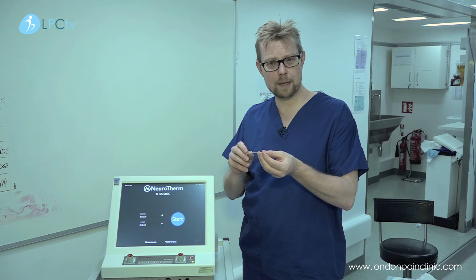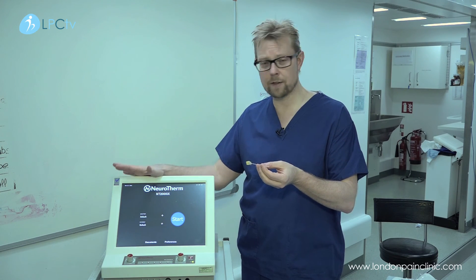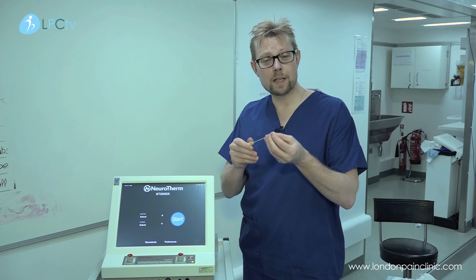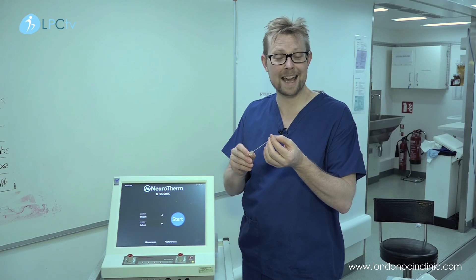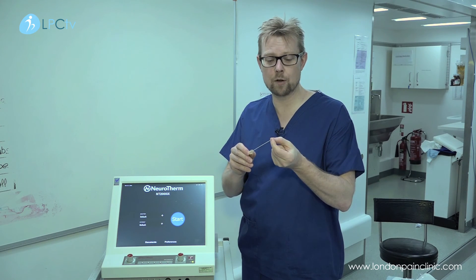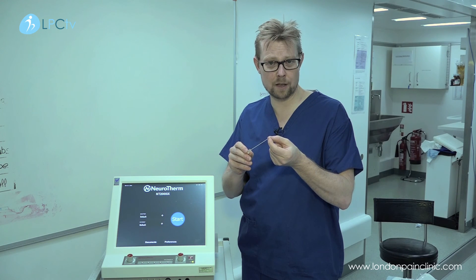Once we are happy that we have exactly the right nerve — none of the major nerves in the back, none of the nerve roots or other associated nerves — we will anaesthetise that nerve and then, using the machine, we will heat up the tip to approximately 80 degrees centigrade and cause a very localised lesion which will burn that little nerve away.